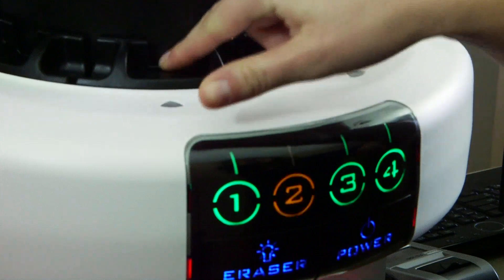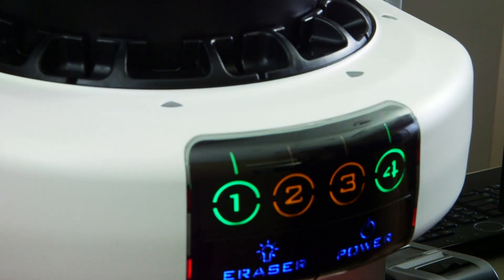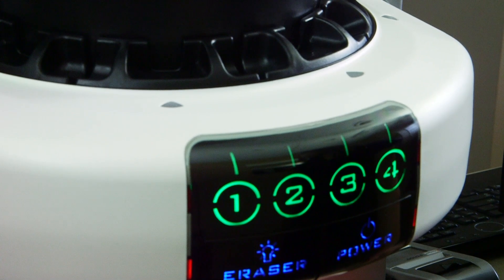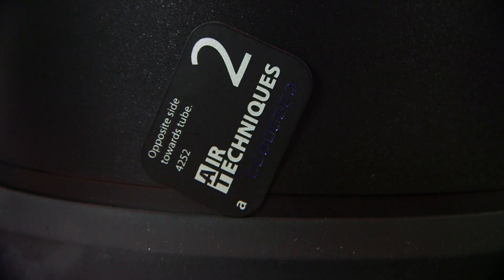Besides fitting every mount, ScanX fits every practice. If you need a system that will do it all, from intra-oral to extra-oral, ScanX Classic is the system for you. We use ScanX Classic because it covers all eight imaging sizes, and with four imaging slots working at the same time, it's a big time saver.